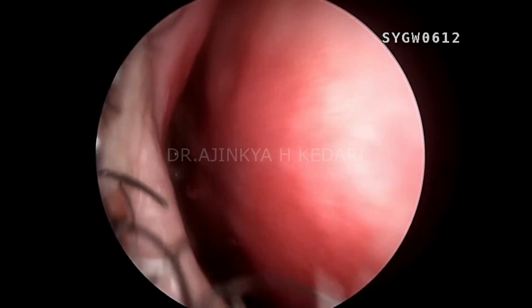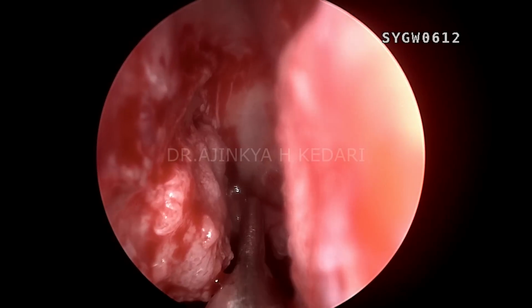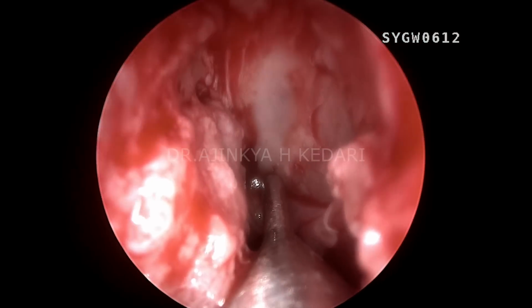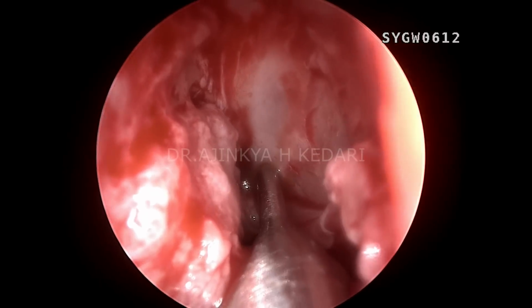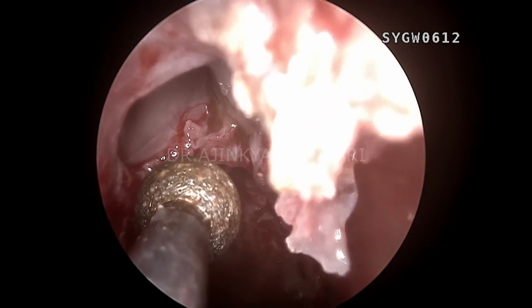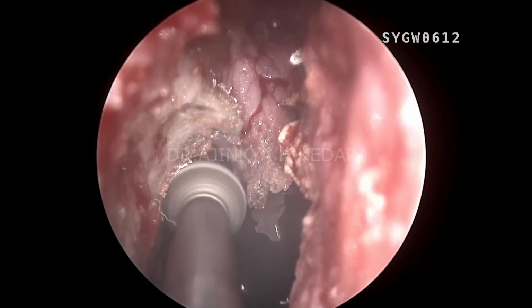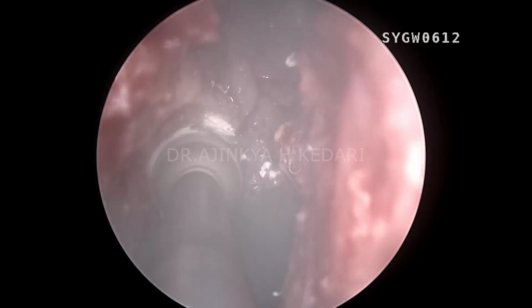What I'm doing right now is calibrating the neuro-navigation system, and I'm putting the probe just at the area of the first olfactory neuron, and cross-confirming that on the neuronavigation system, which I'll show you towards the end of the surgery, how to use a neuronavigation.